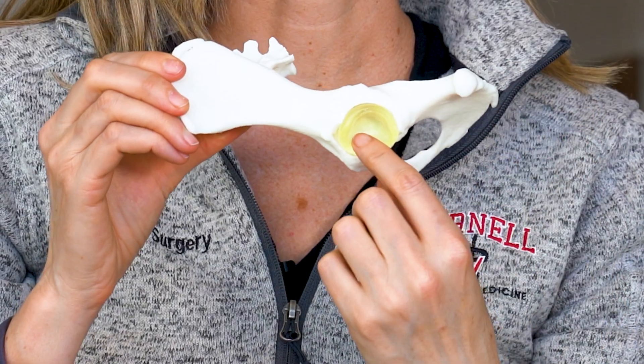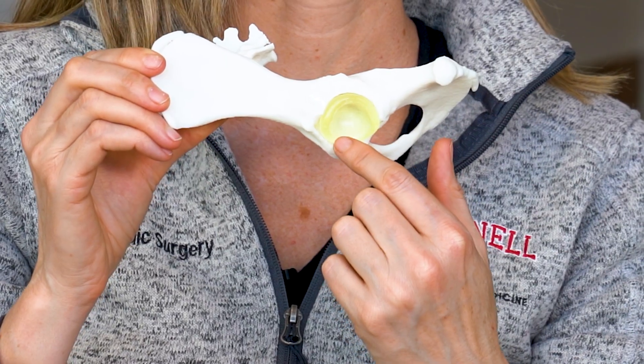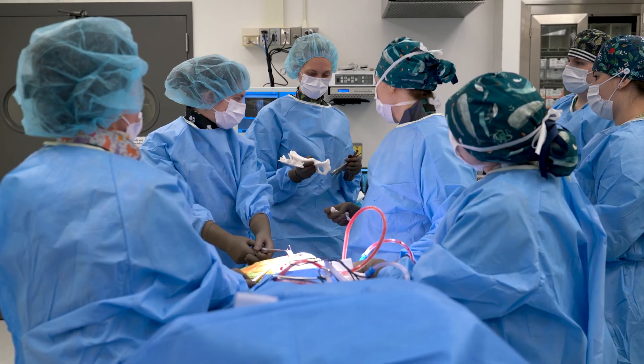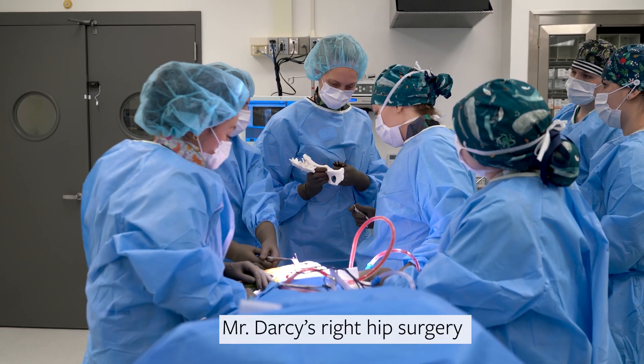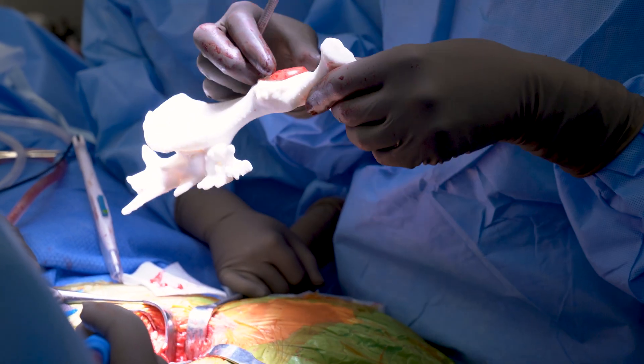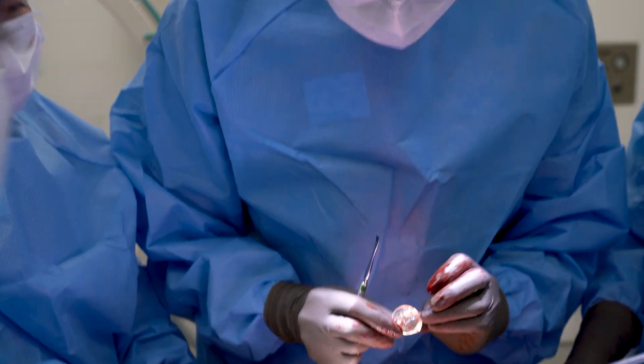In Mr. Darcy's case, I talked to the owner about doing a CT scan in addition to all the x-rays we were doing preoperatively. What that allowed me to do was to print these 3D models of Mr. Darcy's pelvis. I really wanted to get a big cup implant in — right here is a little model of the cup implant — a very big one, to reduce the chance of hip dislocation postoperatively. Having these models allowed me to prove to myself that I could fit this larger implant into his existing bone stock.